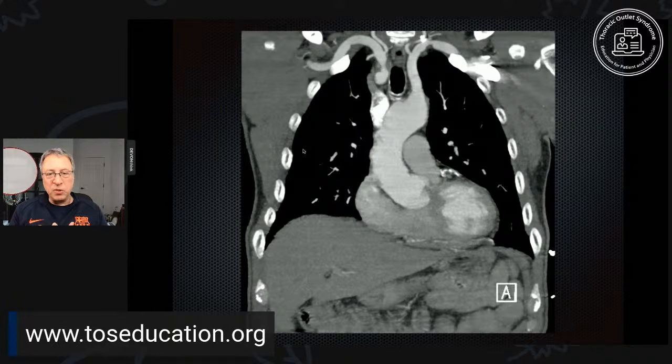We can also see the bones are fairly white, bright, and we see that they come into close contact with the subclavian artery on each side. So that's good. Arteriograms can really show blood vessels quite well and can show them in 3 dimensions. And it can show the bones separate from the other soft tissues.